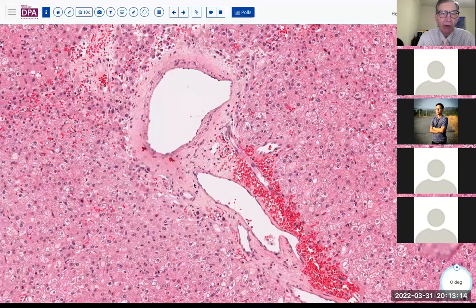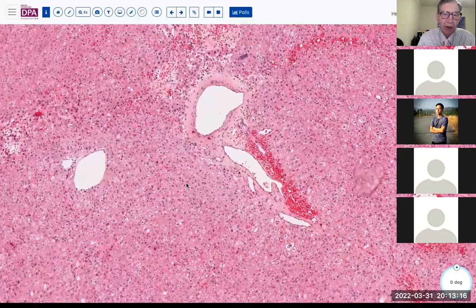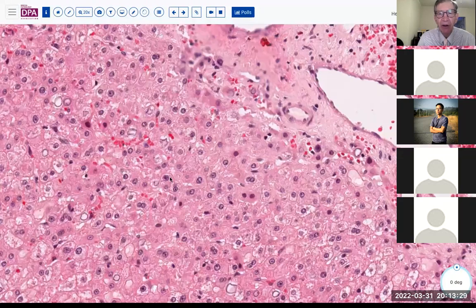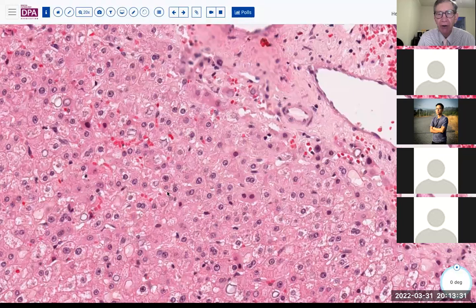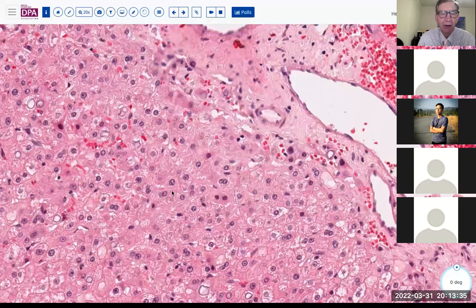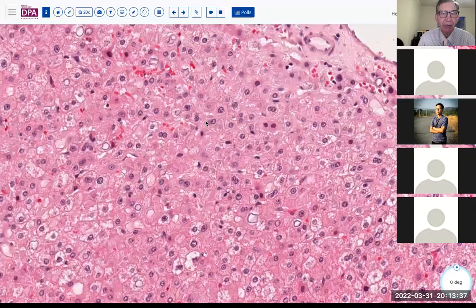And of course, with this lesion, we expect there to be really no high-level anaplasia or dysplasia of the hepatocytes. They look very bland and benign. Because obviously hepatocellular carcinoma can also present with an absence of biliary duct architecture.